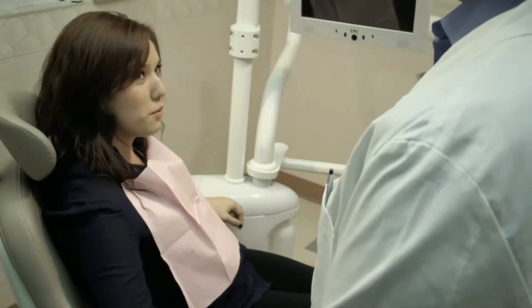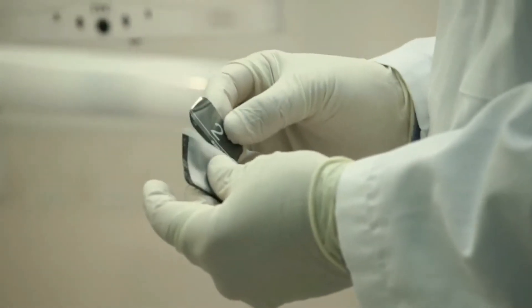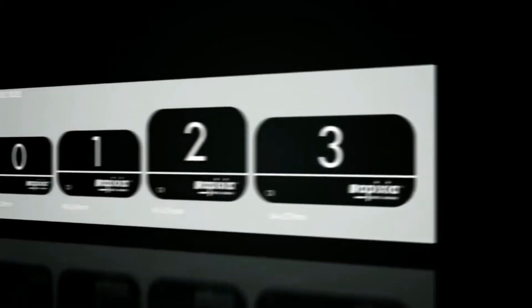Phosphor plates have all the traditional benefits of x-ray film with the speed of high-tech digital radiography. With the wireless Digirex PSP scanner, there's no need for hazardous and costly film processing chemicals. Patient comfort is assured with thin flexible plates in multiple sizes.